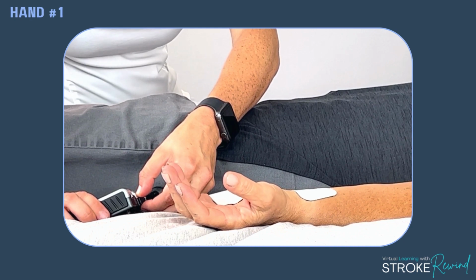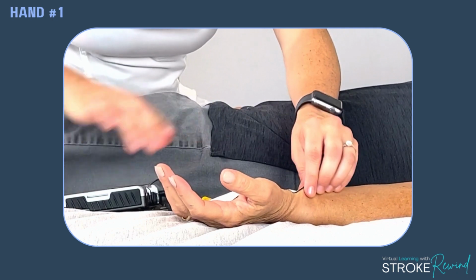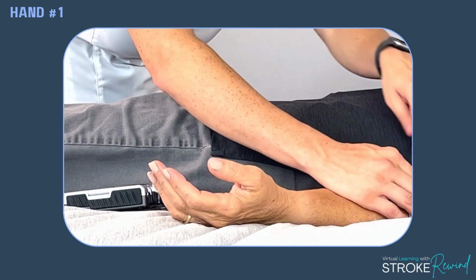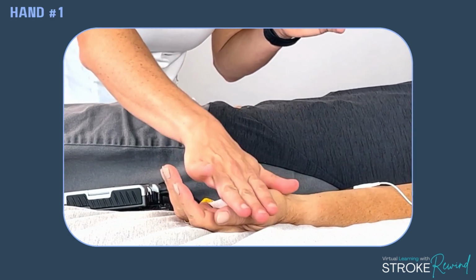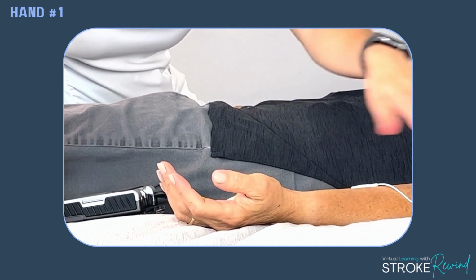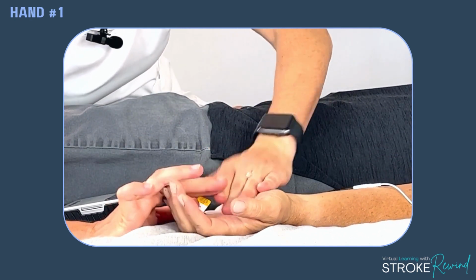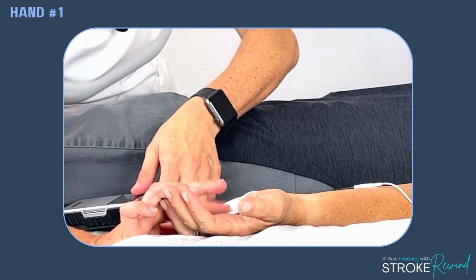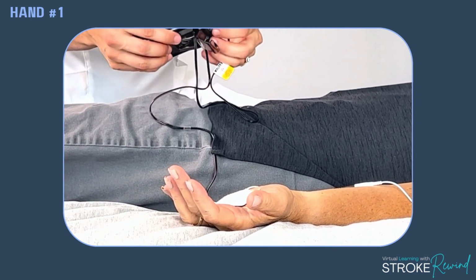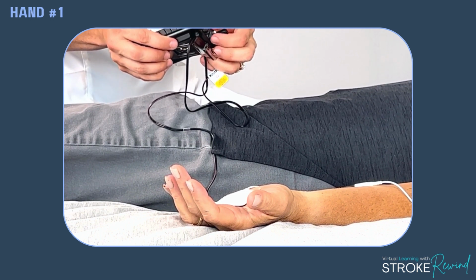And I'll show you one more quick one. Sometimes what I like to do is take this one and place it on the outside of the elbow. So when you're talking about the outside, I'm talking about the thumb side. This muscle right here helps to move the fingers. This is the insertion point. So sometimes I like to do a combination of forearm and hand. And again, you can't mess it up. Just make sure it doesn't hurt the person. It's on the meaty part of the arm. You can do 10 to 15 minutes a session multiple times a day.